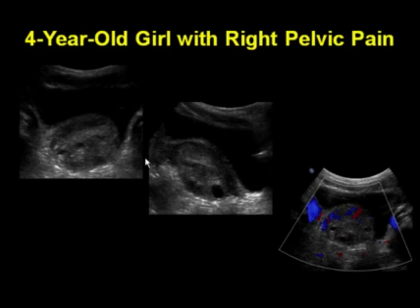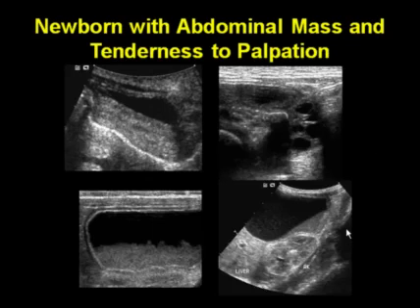Here's a 4-year-old girl who developed the acute onset of right pelvic pain. We could not identify a normal right ovary. Here's a large mass with the peripherally associated little cysts, which are the enlarged follicles. Here's her uterus. This abnormal ovary is plastered up against it, and there is flow at the edge of this lesion, but not within the mass itself in this patient with acute ovarian torsion.